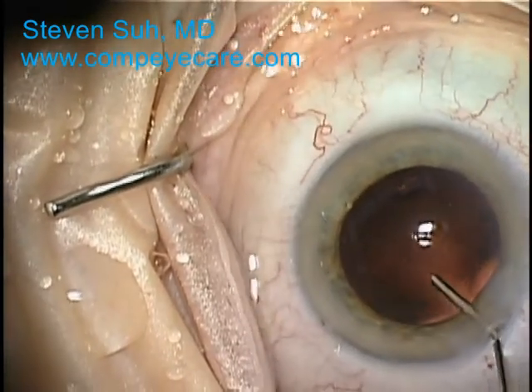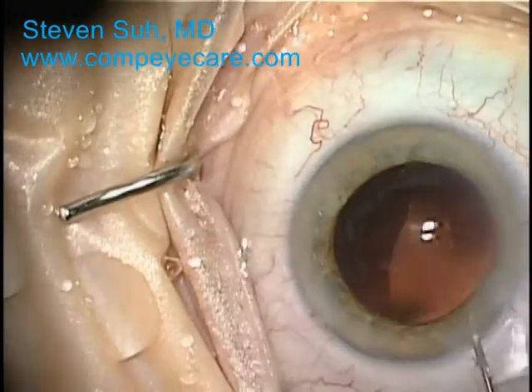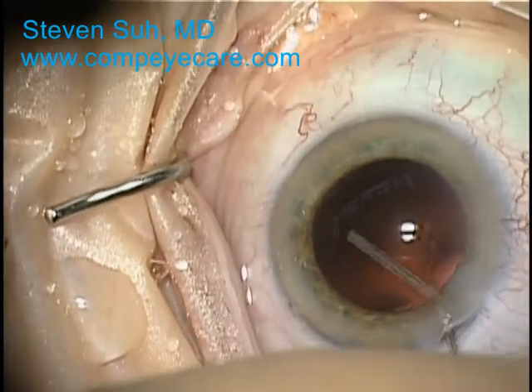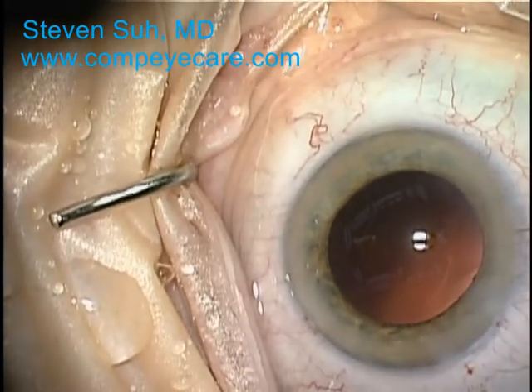Sometimes I power wash the capsule using the saline solution to loosen up the fine strands of cortex. Now you can see that there is a clear capsule. This intact capsule is the reason that the intraocular lens implant, or IOL, does not need to be sutured into place.